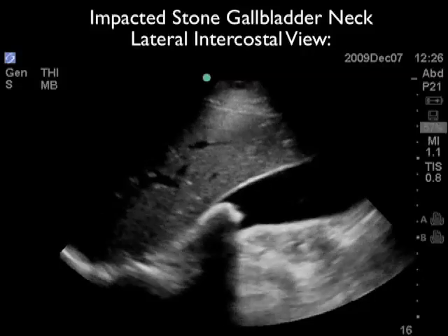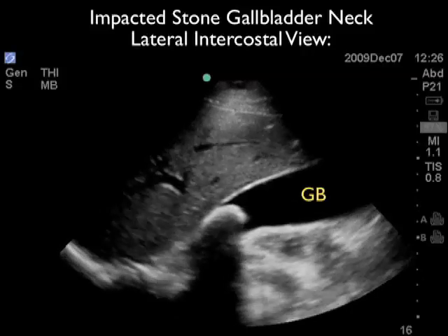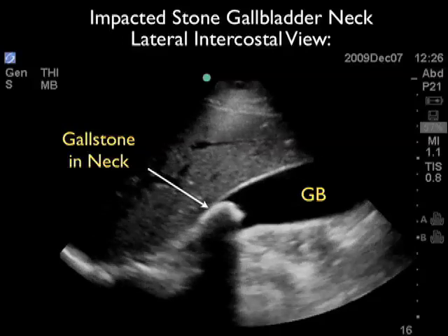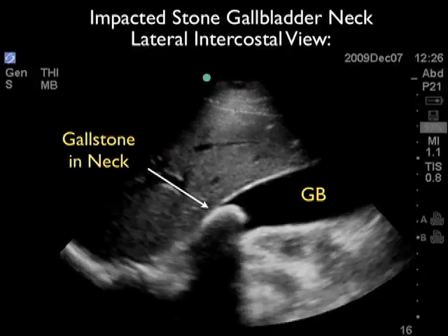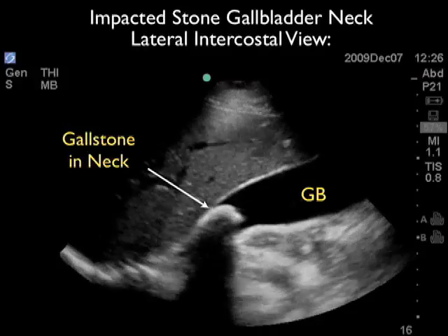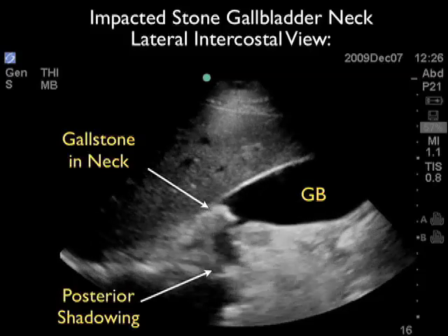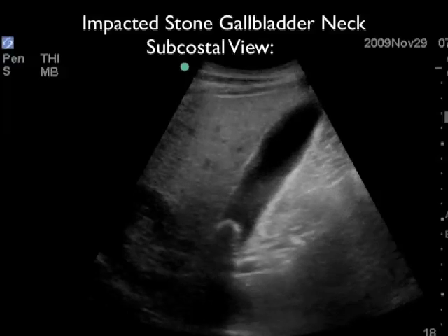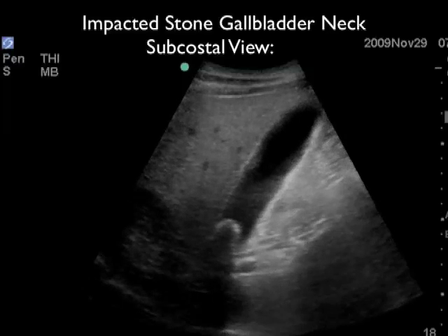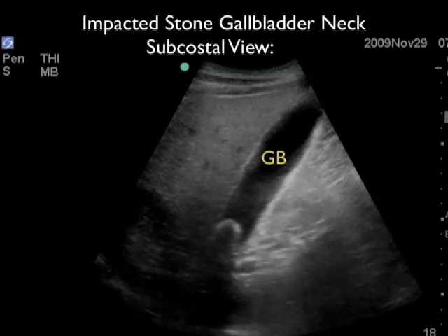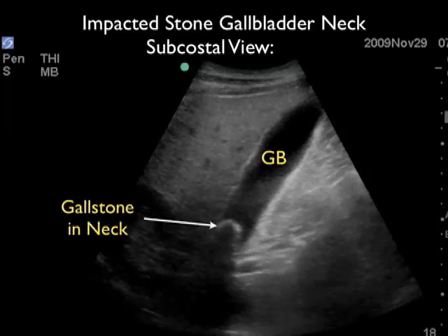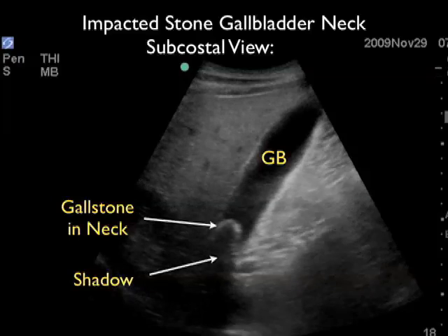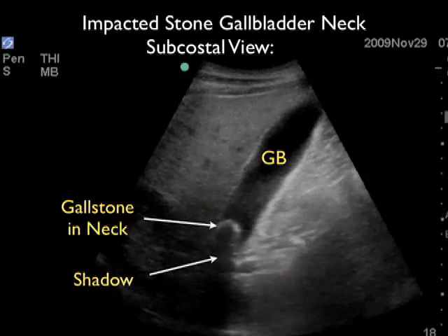Here's a video clip showing an impacted stone at the gallbladder neck, taken from the lateral intercostal view that gives great long axis views. We see the liver at the top of the image and the gallbladder inferior to the liver. Towards the neck of the gallbladder, we see a white hyperechoic gallstone with classic posterior acoustic shadowing. As we mentioned in Module 1, it's always important to look at the gallbladder in two orientations. Here we've moved the patient into the left lateral decubitus position, scanning from the subcostal plane. Again we see the gallbladder stretched out inferior to the liver, with the hyperechoic bright gallstone at the neck and the posterior acoustic shadow.